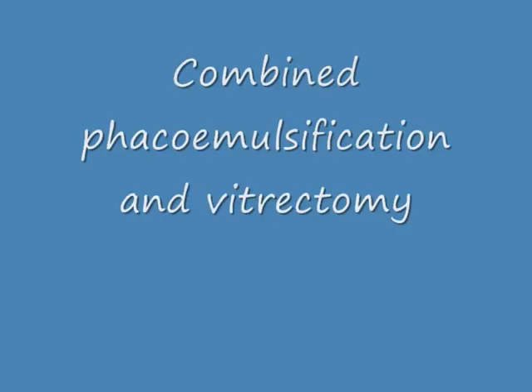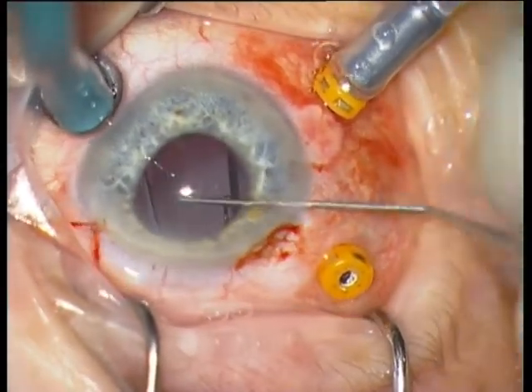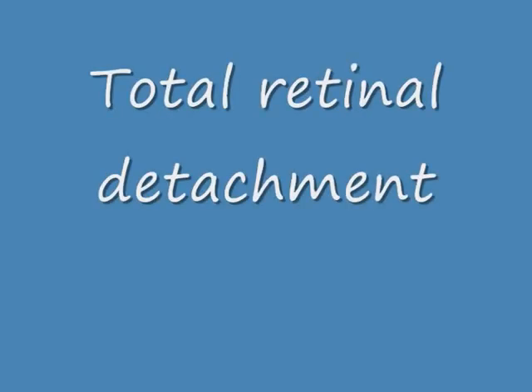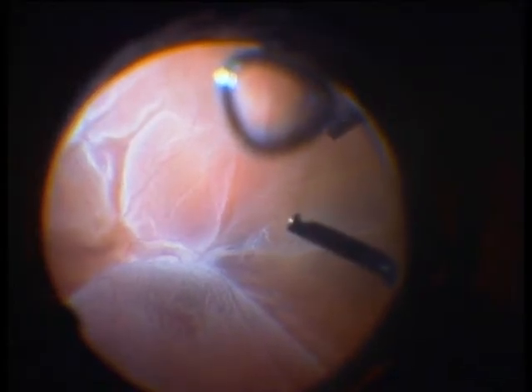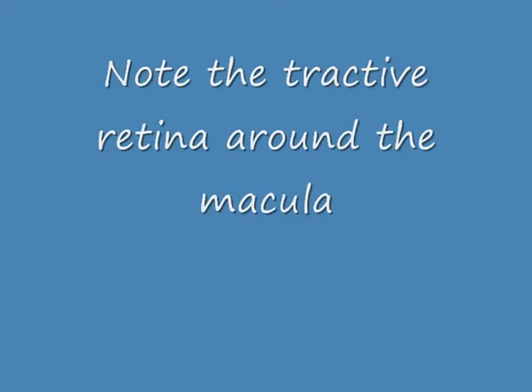I start with phaco-vitrectomy. This is a combined procedure. You can see that I have 23 gauge trocar cannulas. I usually use 25 gauge or 27 gauge trocar setup. This is a total retinal detachment and you see here the rupture, which is very centrally located — an oval rupture with choroidal atrophy.